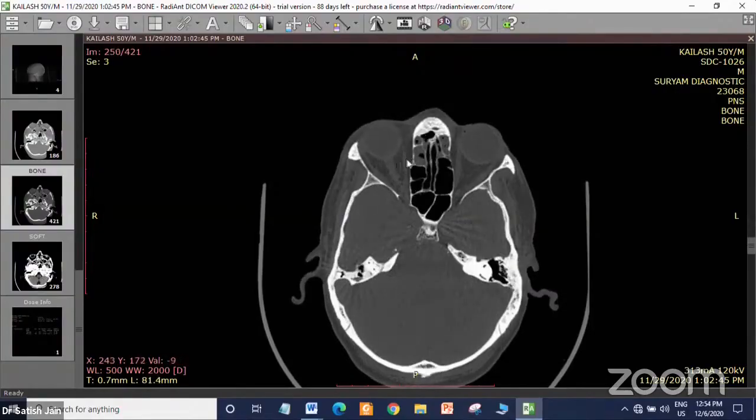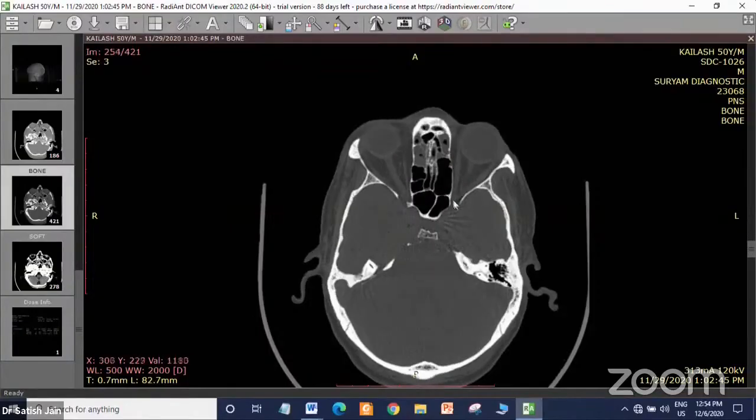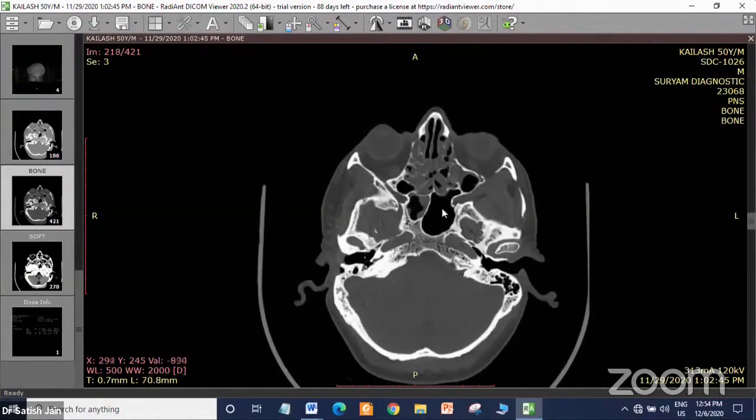This is your medial rectus muscle, and this is your lamina papyracea anteriorly. There is 4.5 or so, 4.8 millimeter of fat between the lamina and the muscle anteriorly. In the posterior ethmoid, there is no fat in between. If you injure the lamina, your muscle is right there. Any distance you can measure in any plane, any angle.